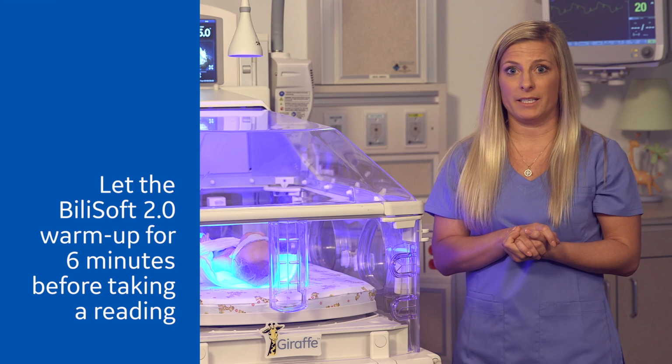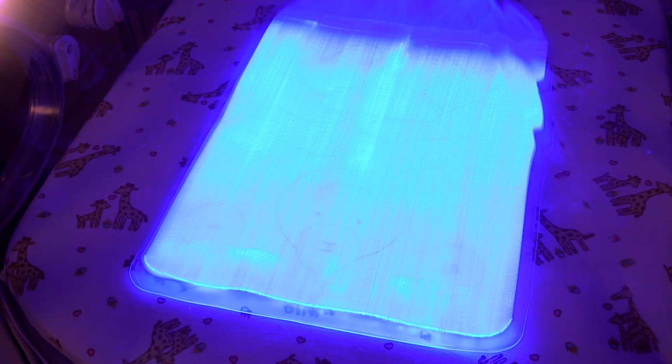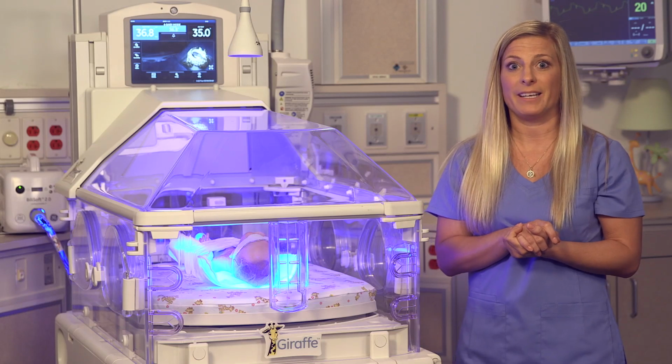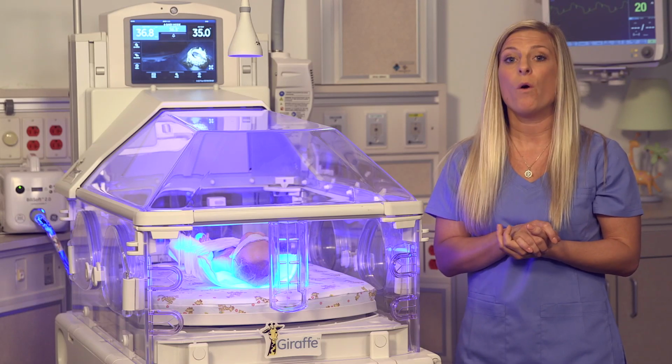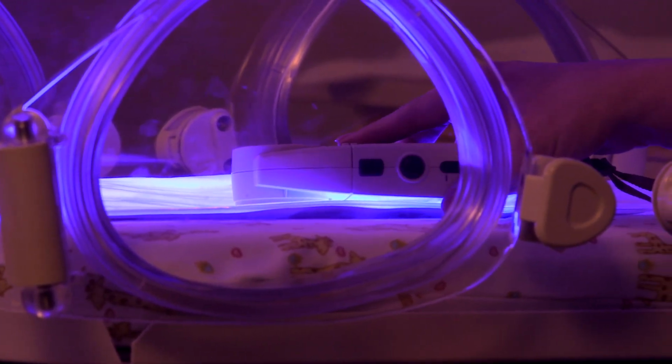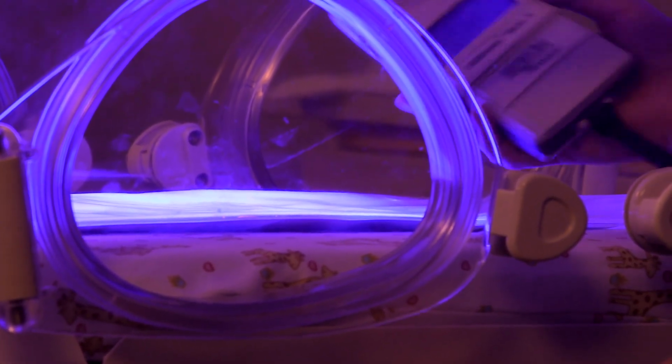While you are waiting 6 minutes for it to warm up, place the fiber optic light pad on a flat surface. Do not place the fiber optic light pad inside of a BiliSoft pad cover or BiliSoft Nest at this time. Use a calibrated bilimeter that is approved for the BiliSoft 2.0.